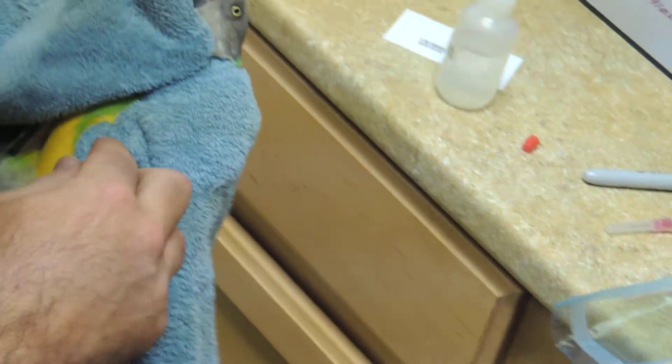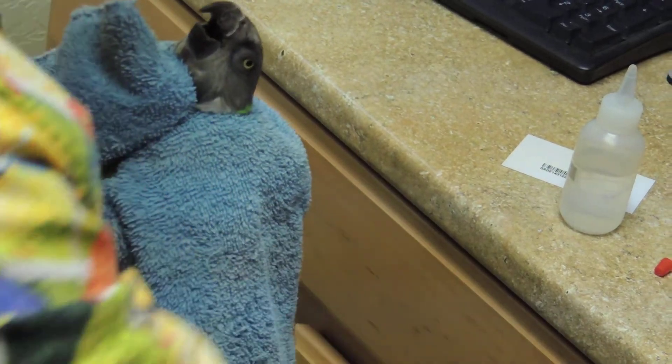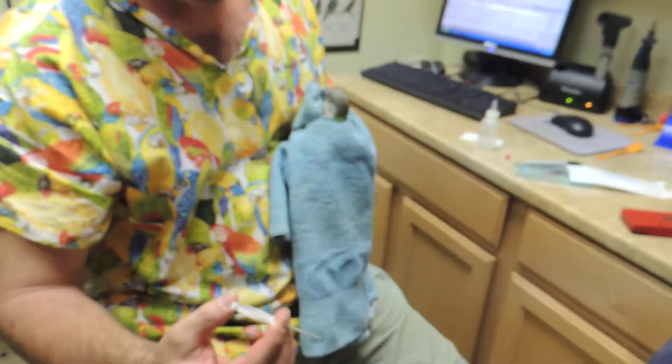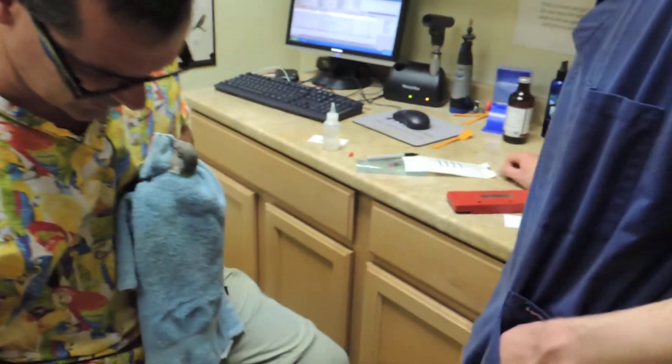With this, if I would have had him hold — I didn't think about it — I'm squeezing like that and it catches. So you almost need somebody else to hold, unless... whoops, we didn't get it in.